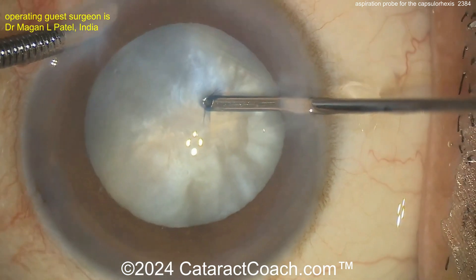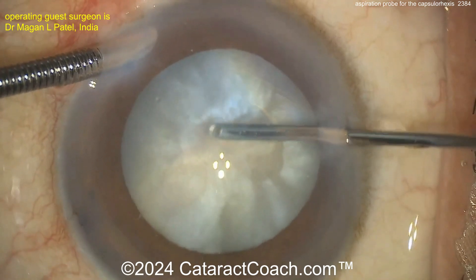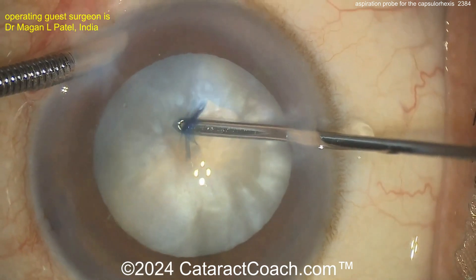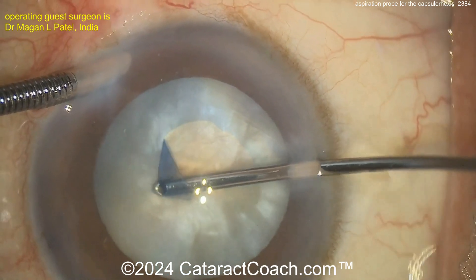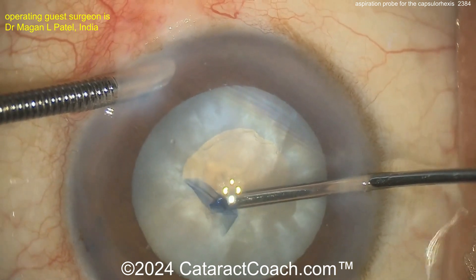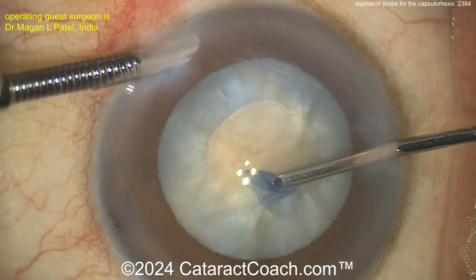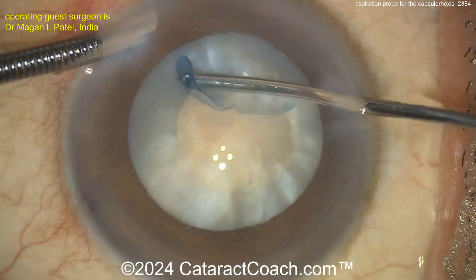Hold onto it with some vacuum. And then look at that — you can create your capsule. Innovative technique here, not something I've tried before. Using the aspirator to even further decompress the capsule bag. For me, I just prefer to use the forceps here. Creating the capsular rhexis — that looks like it's a little small. I'd prefer a little bit larger rhexis than that. And continuing it. With the AC maintainer there, you can see the fluid currents caused the capsule to flop around a little bit. But there it is — a complete rhexis.